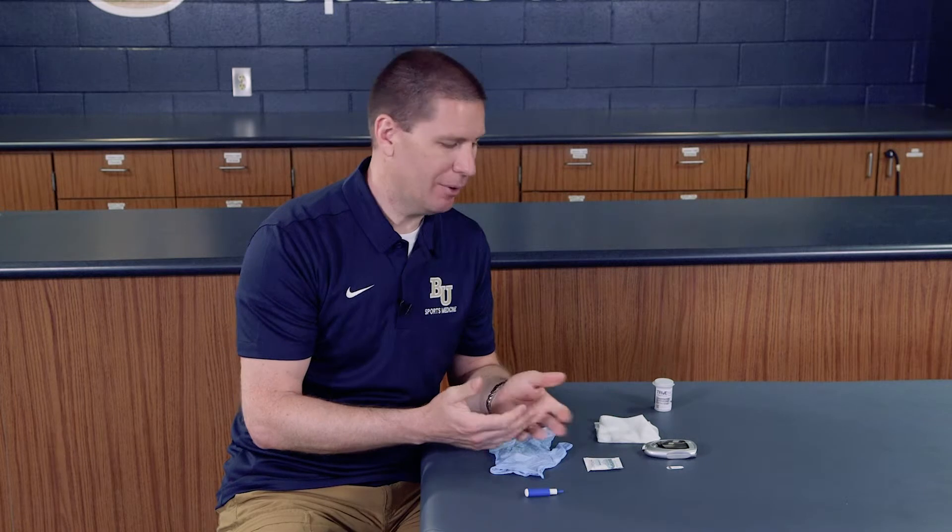This particular skill is testing blood glucose levels, generally for an individual that might have type 1 diabetes. You want to make sure that either periodically throughout the day or even throughout practice you have the ability to measure them. A normal blood glucose reading is right around 100 milligrams per deciliter. Anything below 50 can be problematic, and anything above 150 can be problematic, so getting a reading around 100 is fairly normal.